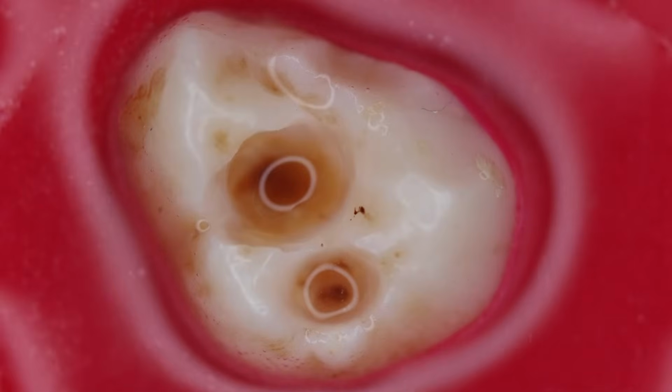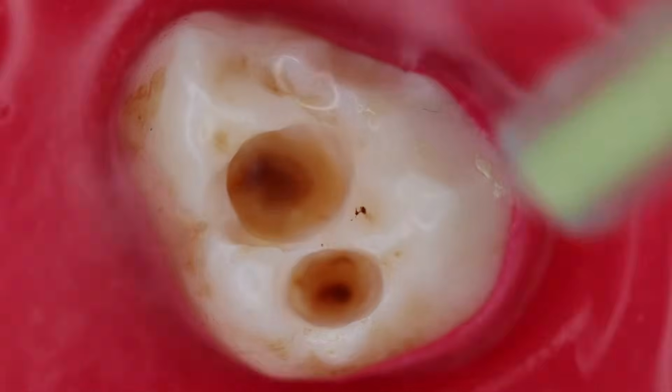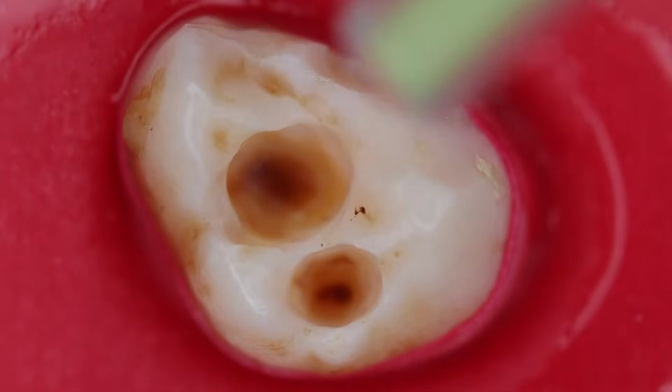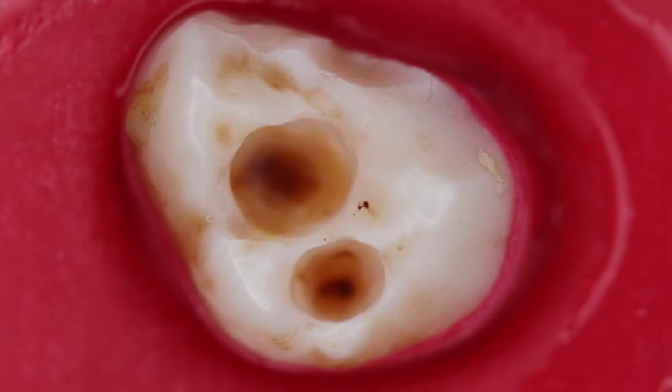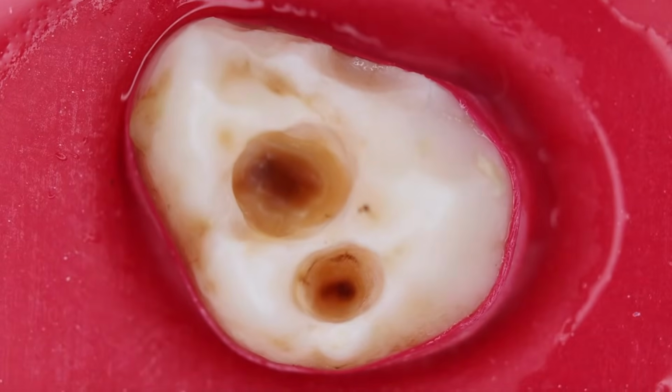Now visually inspect if things are going correctly. See how much of the caries has been removed, and we are going inside the tooth.